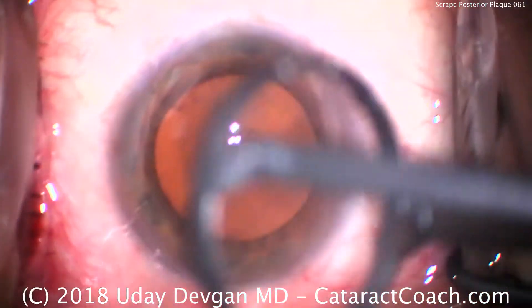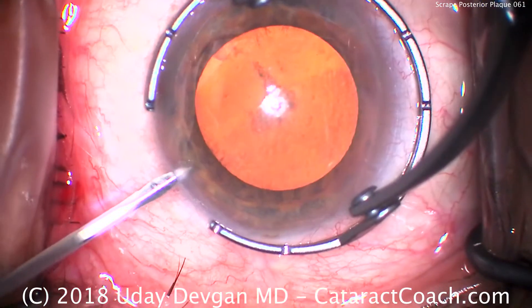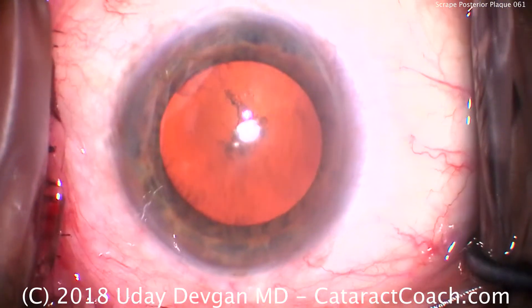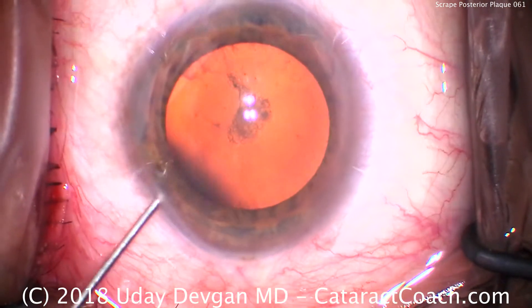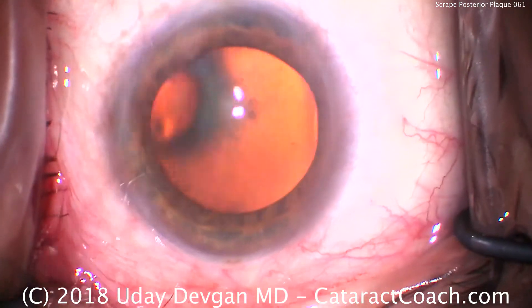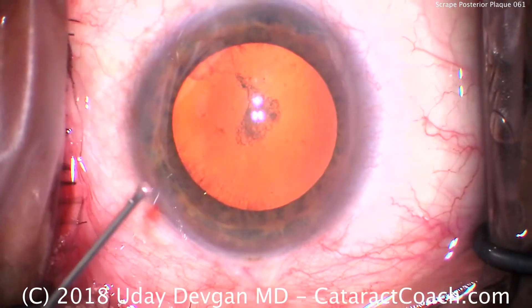This is cataractcoach.com with a case of a posterior plaque. Looking at the video, you can see the posterior capsule has a very centrally dense posterior subcapsular cataract. That's going to be adherent — I'm going to show you my way of safely and quickly removing that plaque.